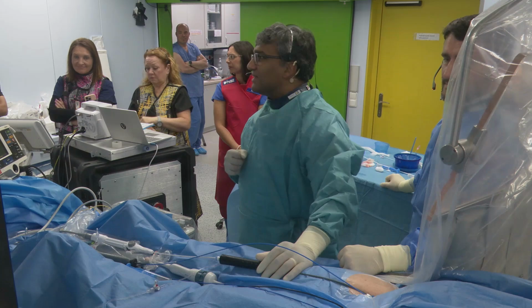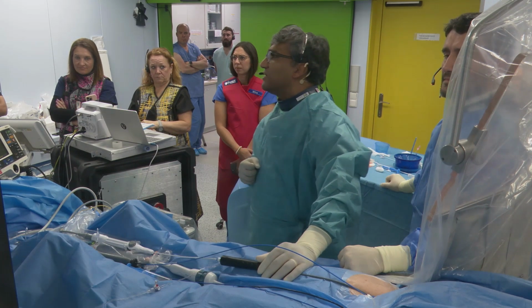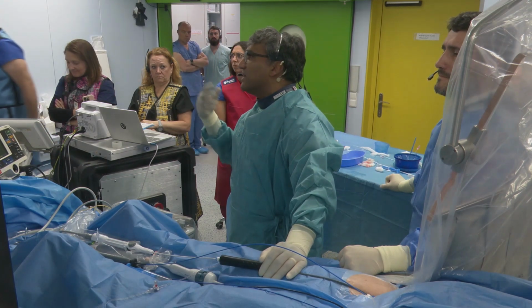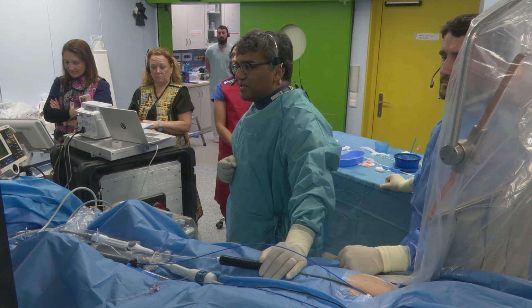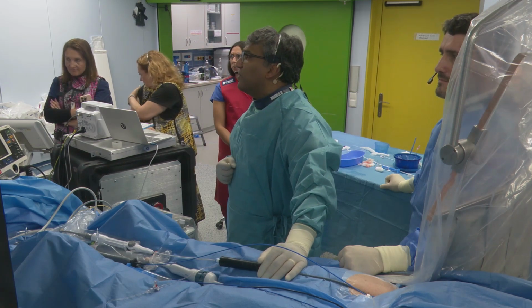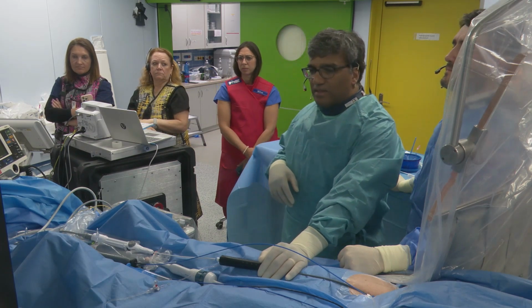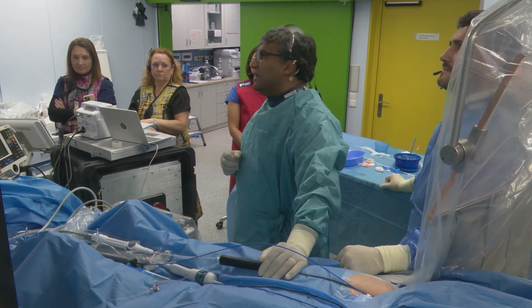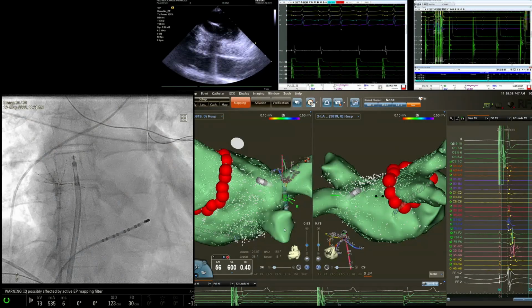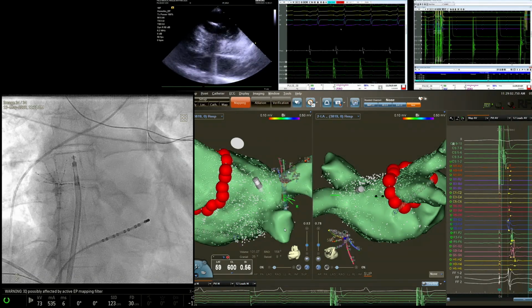So we have a patient who has paroxysmal atrial fibrillation, who was receiving propafenone, also has some flutter, and she's enrolled in a clinical study using the Field Medical focal ablation technology. This is the one that we showed yesterday for VT ablation. The problem that we're having is some technical issues. It's actually not related to Field, it's related to the cardio system. We've been troubleshooting for the past, I think, hour and a half or 2 hours.